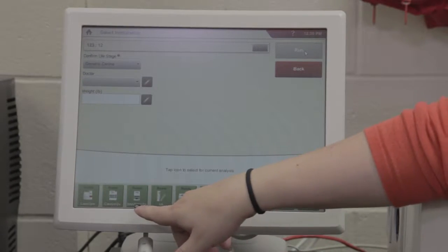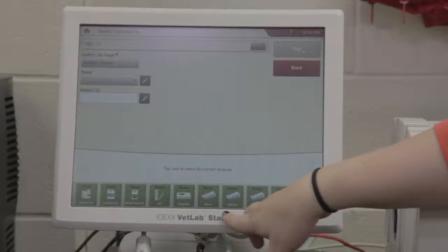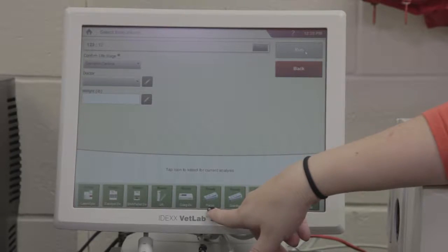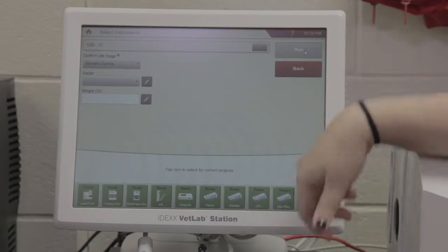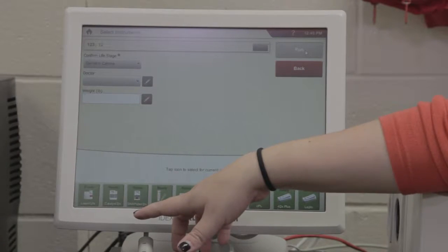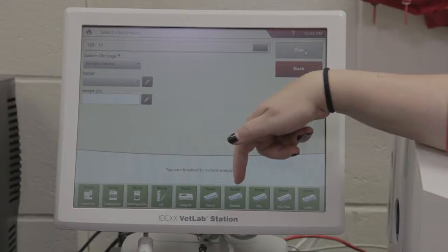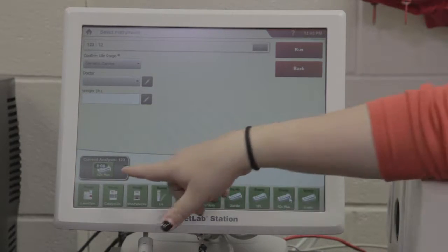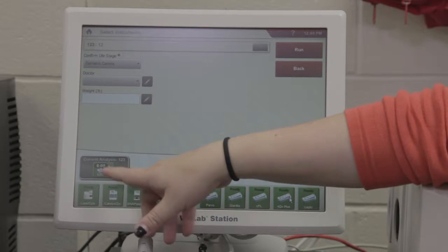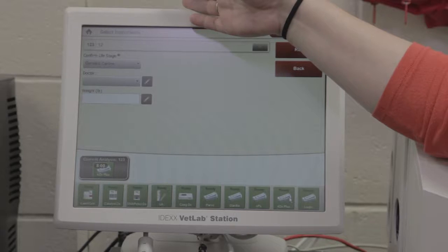So you have your SNAPshot, and you can use that to run any of your snap tests, but you also have each snap test listed out individually for this species. Since we chose a canine, it's all of the canine snap tests. So say your SNAPshot was full, it's heartworm season, you're in a busy practice and you're running back-to-back-to-back heartworm tests. Your SNAPshot could be full, but you have that third or fourth heartworm that you really need to run while the owner's waiting. You could choose the 4Dx Plus, and it will put the icon up here and allow you to use the Vet Lab station as a timer, and then also allow you to enter your results on here as well.